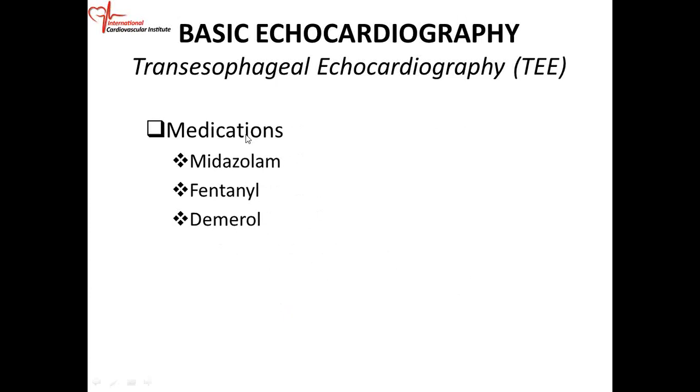So when we're doing this procedure, of course, you have to keep the patient NPO, explain the procedure to them, and let them sign the consent. They come in, you put them on the monitor, you measure the blood pressure. No, you don't have to give them oxygen, but you put your blood pressure cuff on, you monitor blood pressure every 5 to 10 minutes, continuous ECG monitoring, you have your suction equipment set up, and then you have to use certain medications.